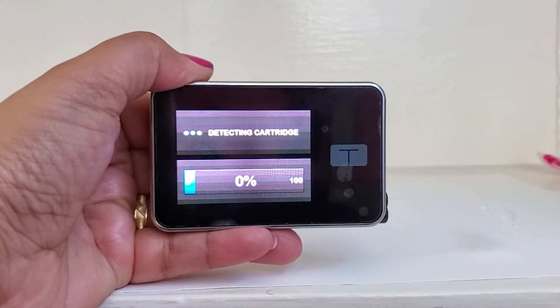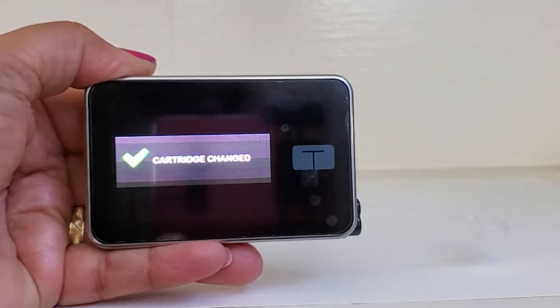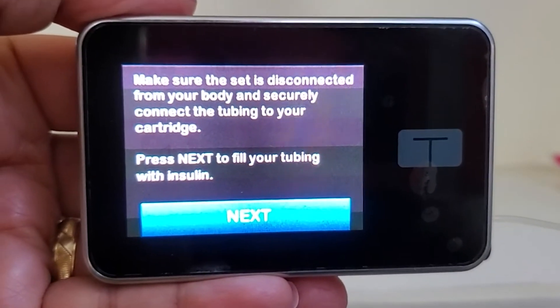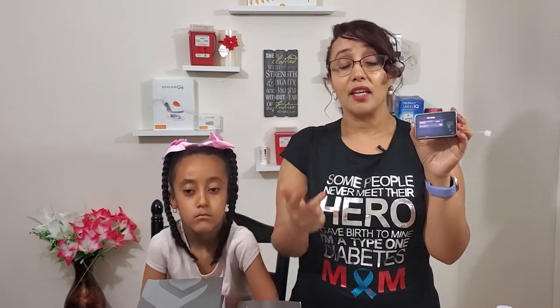It's detecting the cartridge — 100%. The cartridge is confirmed. Next step: fill tubing. Fill the tubing and connect the infusion site.